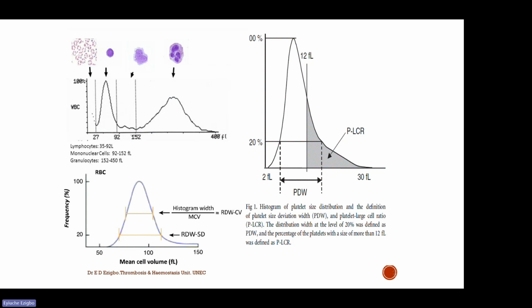You can see this is for what? This is for red blood cells. It's unimodal. It starts from the base and ends at the base. So you'll be looking for the characteristics of a normal histogram that you should have. And you can see it's unimodal, one peak. I think this is platelets. You can see it starts from the base, moves unimodal, goes down.